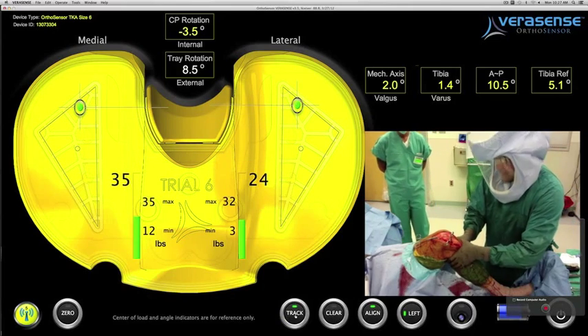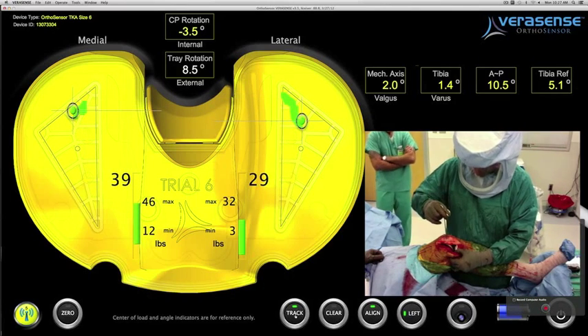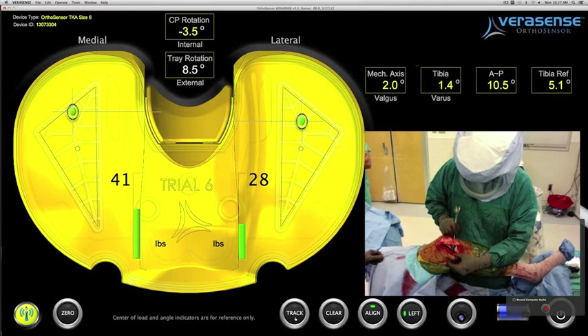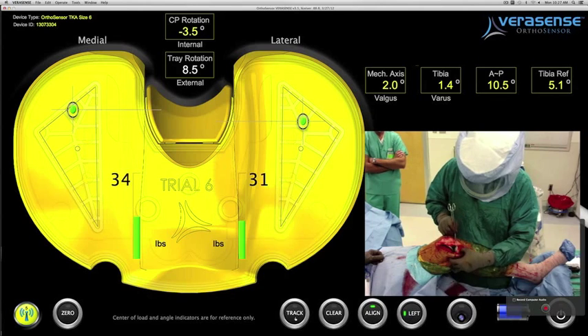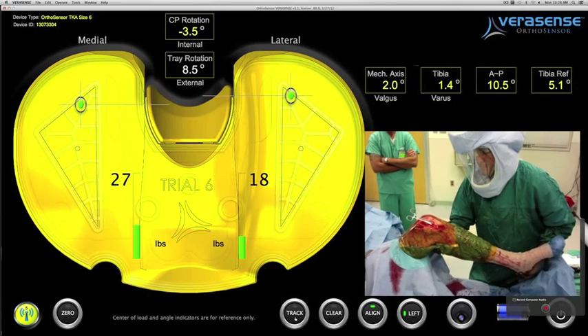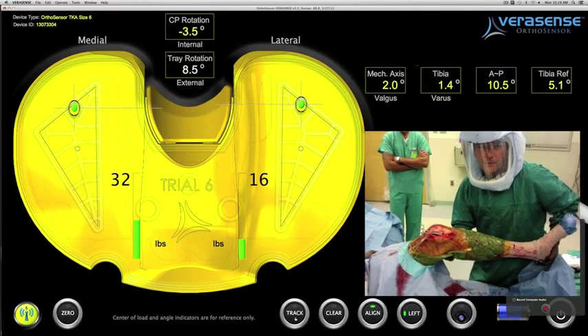He evaluates the rollback, which is symmetrical, and has a stable posterior drawer depicted by the contact points staying centralized. He puts the knee into the mid-flexion to flexion position, palpates the tight anterior medial collateral fibers, and with a pie-crusting technique improves the flexion as well as mid-flexion loads.